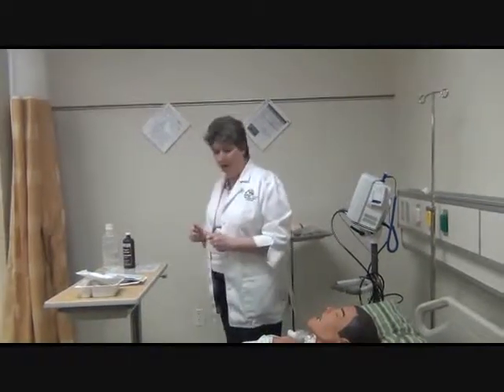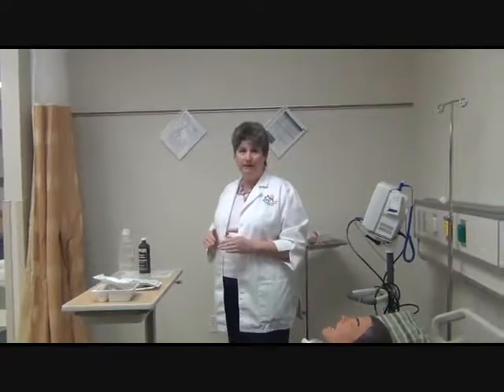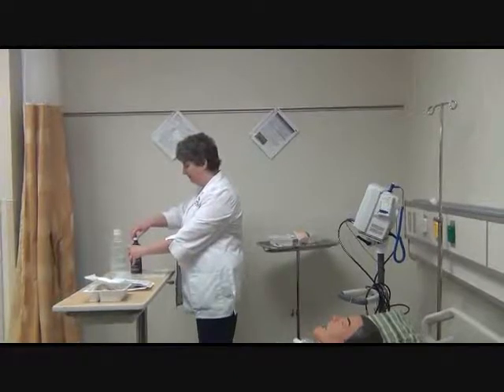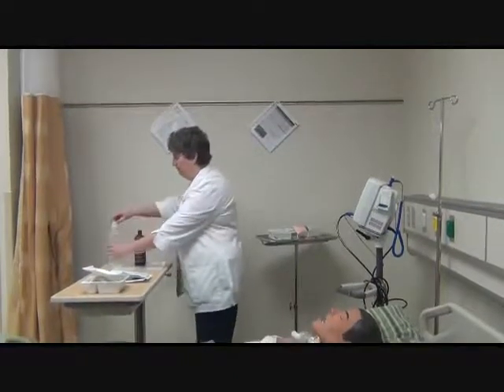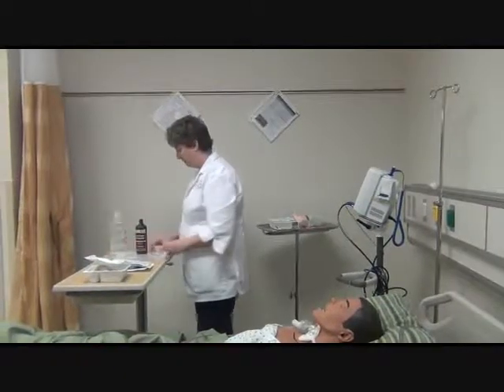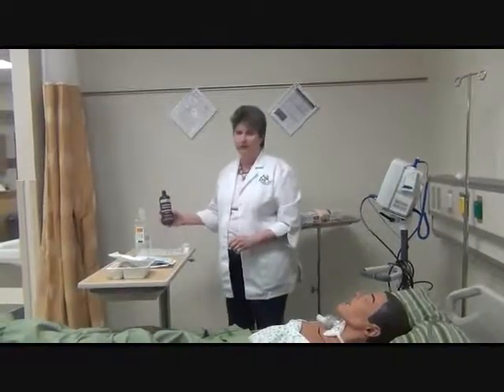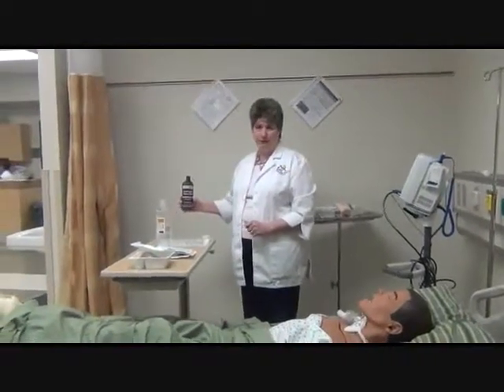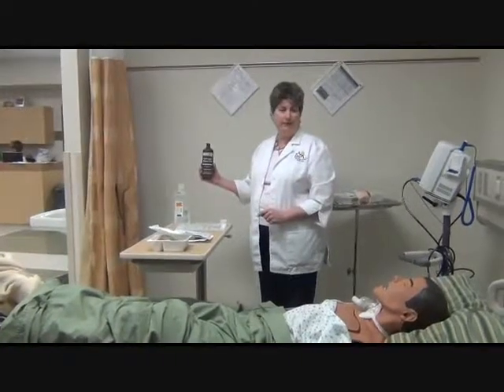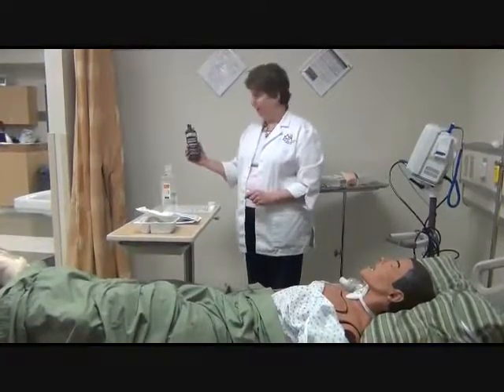All right. And what I like to do, personally, is always open up my sterile kits first. I'm going to undo my water. I'm using a 0.9 sodium chloride or a normal saline solution, and then most of the time they want you to use hydrogen peroxide. Again, this will help break up any of the mucus secretions that are on the cannulas and make it easier for you to clean.